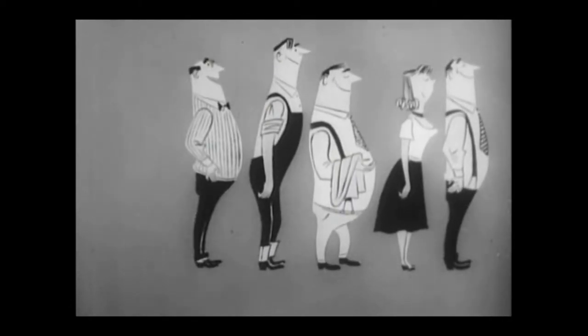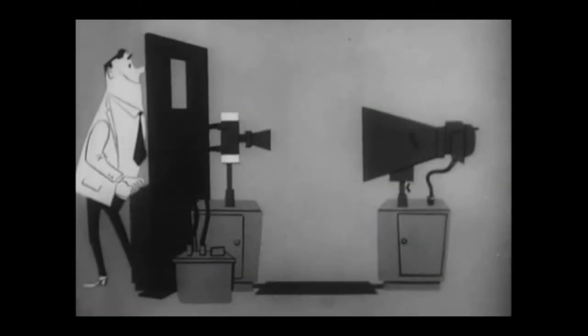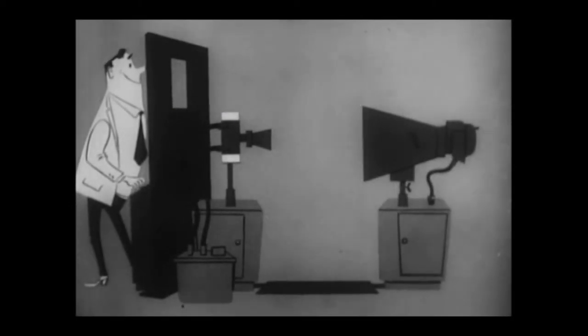Every day, hundreds of people line up at Ike's PF machine to get a chest x-ray. Every day, he shoots the x-rays as fast as the equipment can take it.